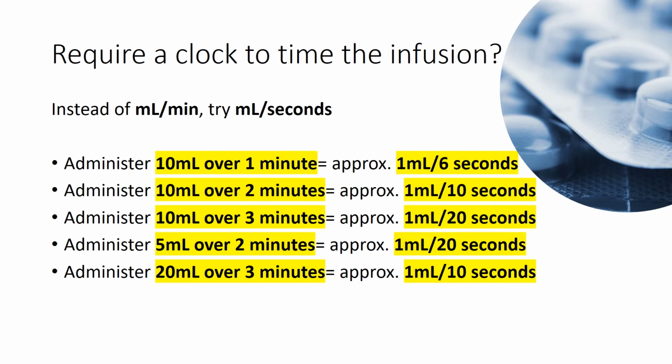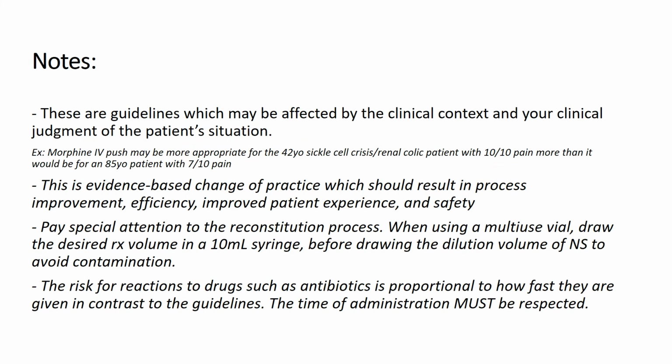A few notes to remember. The clinical context and your clinical judgment must guide your decision to administer the medication IV push or not. There are expected benefits in terms of process improvement, time, efficiency, patient experience, and safety. Practice reconstitution to avoid contaminating the multi-use vials, for example that of dexamethasone.